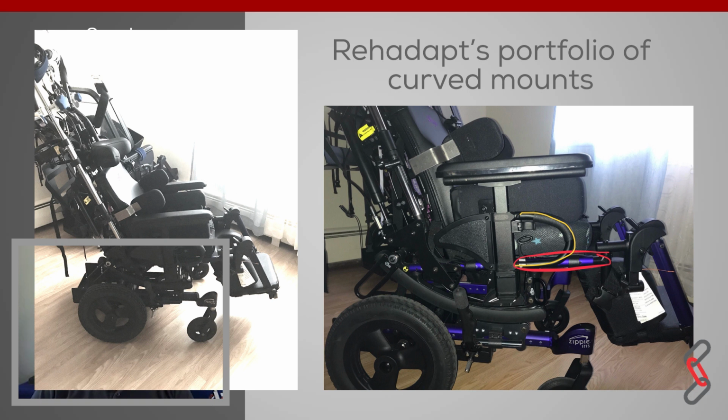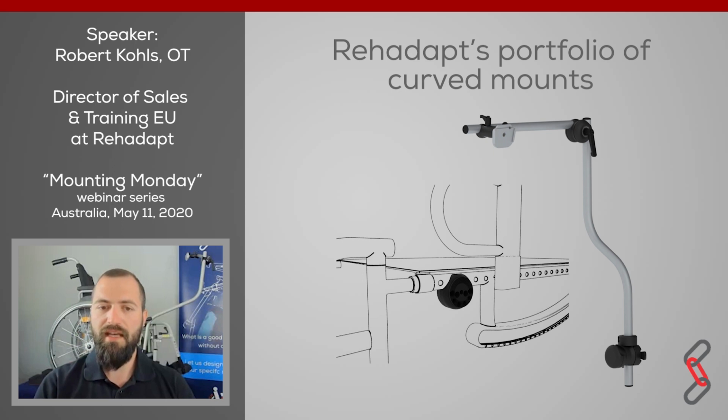So when we are looking a little bit closer at that wheelchair, we will see that there is a tilting functionality, and there are some tubes under the seating plate where we could attach also again a frame clamp and combine it with a mounting solution. So here you can see a round tube. It is covered from the seating plate. That would mean we would need here a semi-open frame clamp that could be attached to that kind of chair. That also follows then the tilting functionality of the wheelchair.